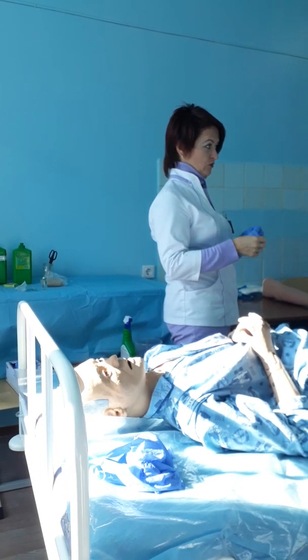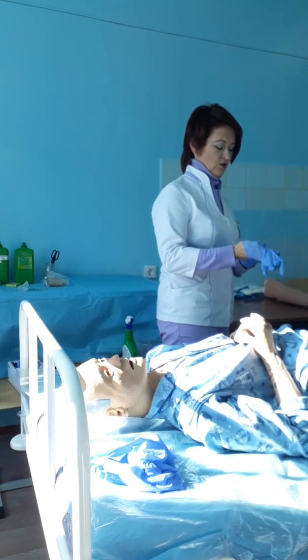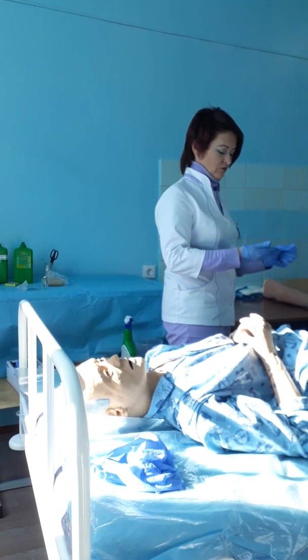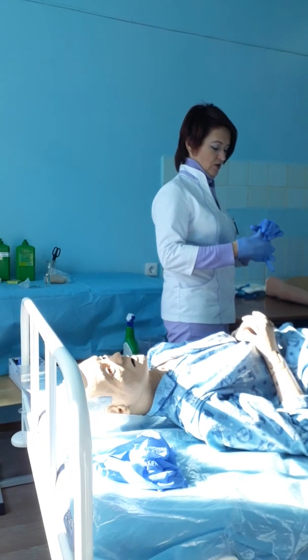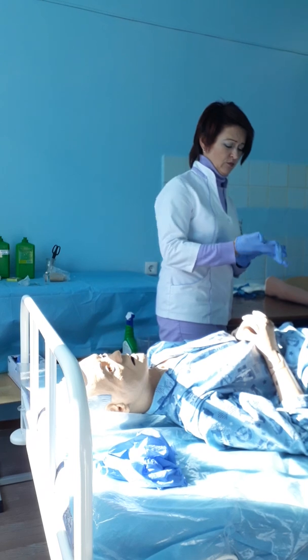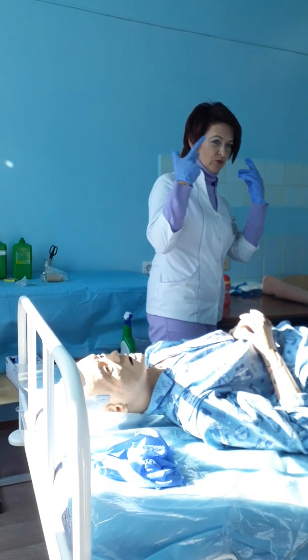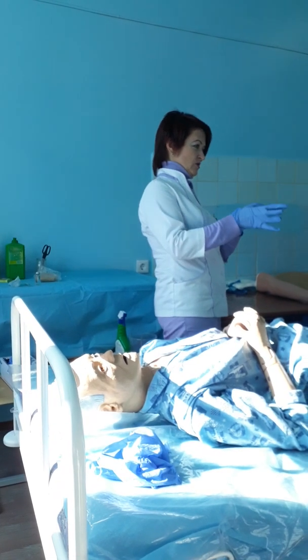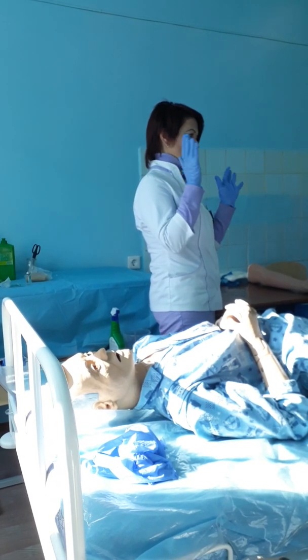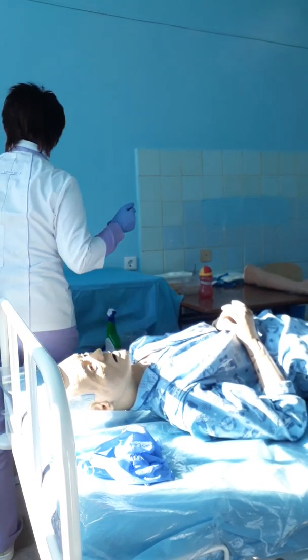For intravenous injection, this is very, very important, and you have to work with gloves all the time. And when you aspirate blood for analysis, you will use a mask and special goggles. For injection, only non-sterile gloves. And you start to prepare.